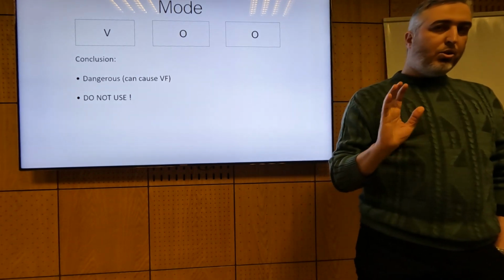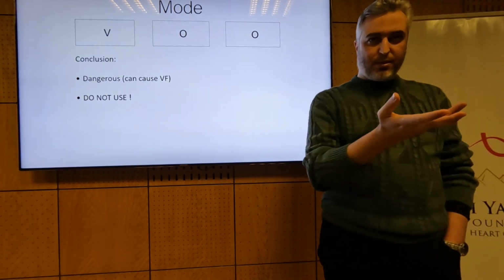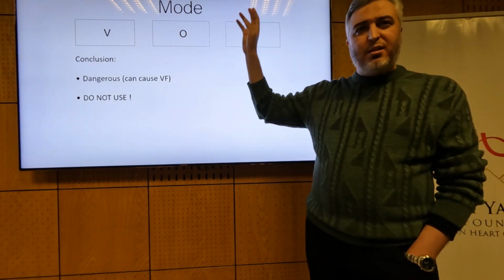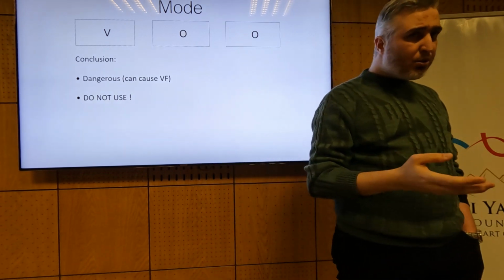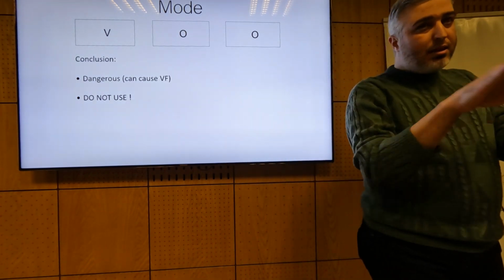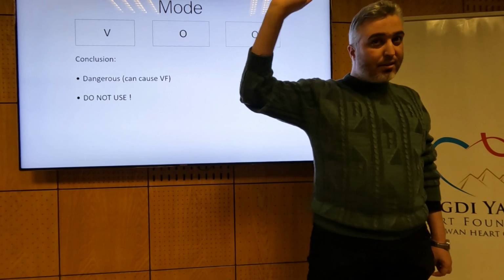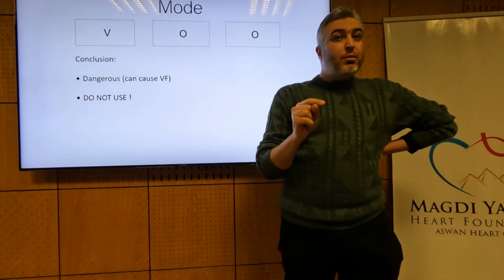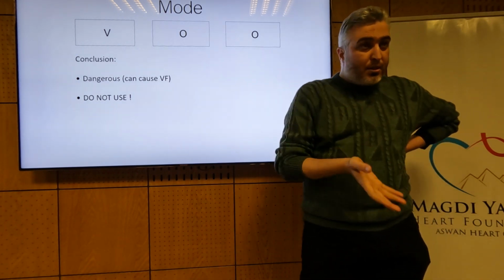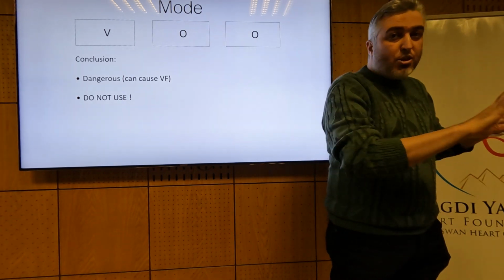Reopening the chest requires using electrocautery, diathermy. Electrocautery works by electricity, obviously. What is sensing? We just keep ventricular sensing. What is the pacemaker actually doing while sensing? It just senses electricity that is higher than the number adjusted. And trust me, the diathermy gets a lot higher than that. Then the pacemaker will assume that this is actually ventricular activity, so it will inhibit ventricular pacing. This specific patient does not have an escape rhythm. So whenever you use the diathermy, pacing stops, heart stops.